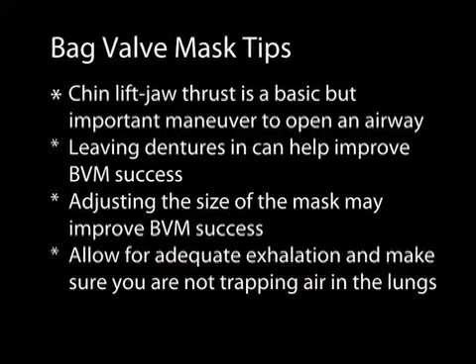When using a bag valve mask, the chin lift jaw thrust is a basic but important maneuver to open the airway. Leaving dentures in can help improve BVM success. Adjusting the size of the mask may improve your success, and allow for adequate exhalation and make sure you're not trapping air in the lungs.